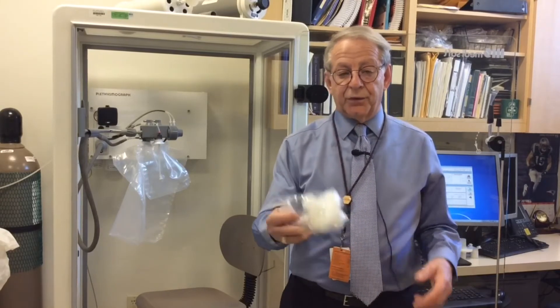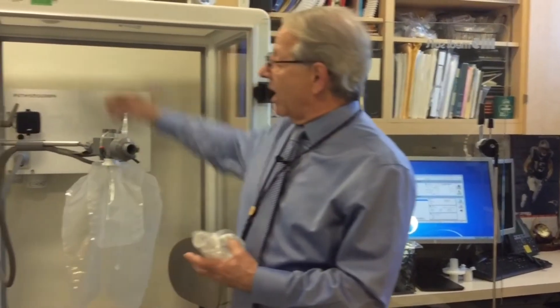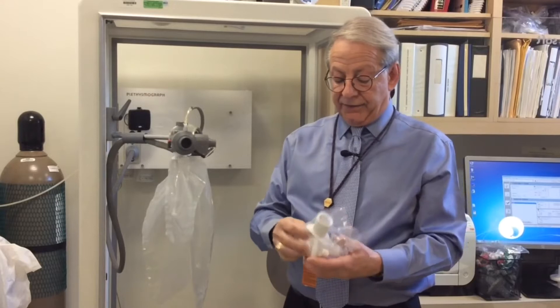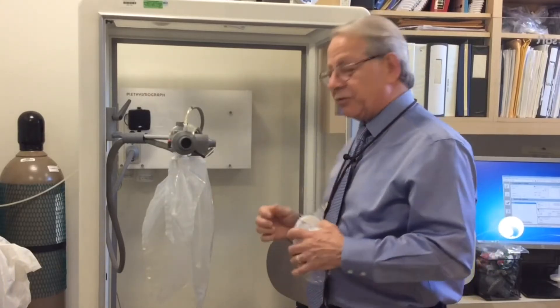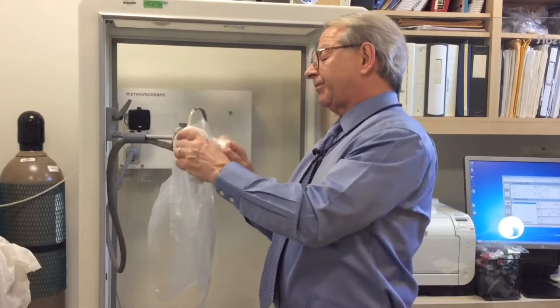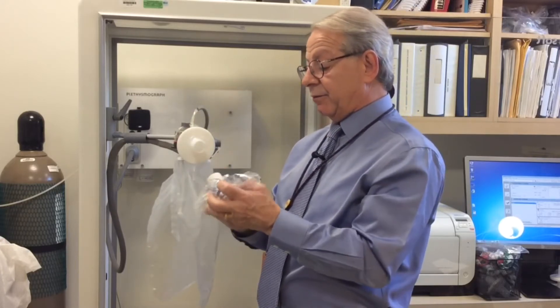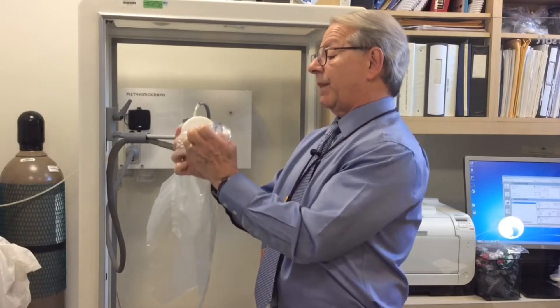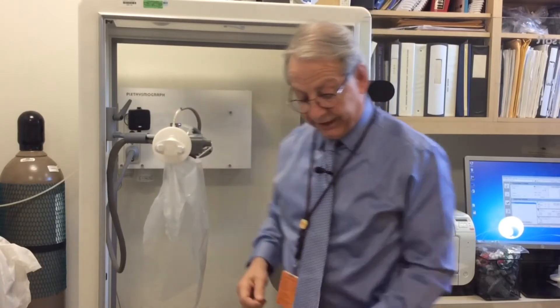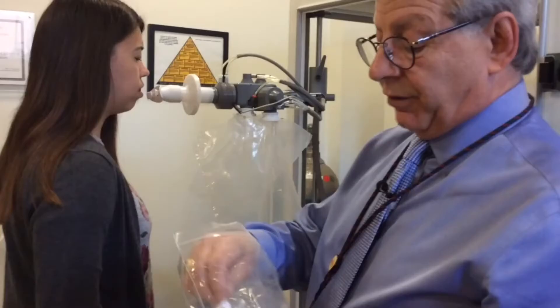What I'm going to do is put a filter on a mouthpiece and then Danielle is going to perform a test for us today. This is the body box, and we have this manifold that slides out so we can adjust it to the patient's height. If we have somebody that's like 6'4, we usually have them take a seat in the box. I'm going to place the filter onto the manifold and attach the mouthpiece to the manifold.